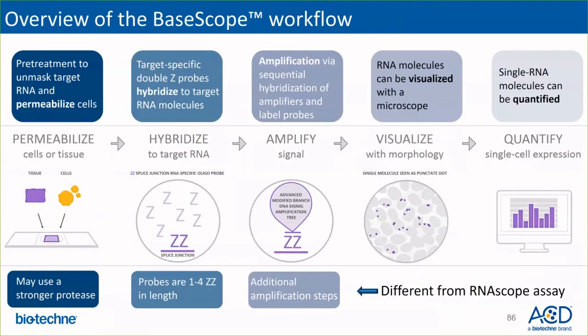The assay workflow for BaseScope is very similar to RNAscope. Based on our experience, the BaseScope assay may require stronger pretreatment due to additional amplification steps required. As a note, do not mix the RNAscope and BaseScope reagents as they are not compatible with each other.